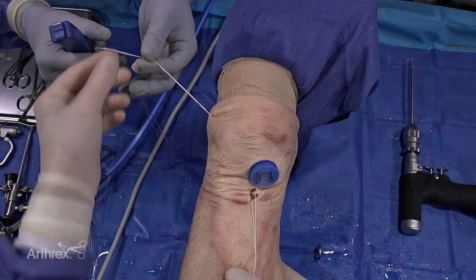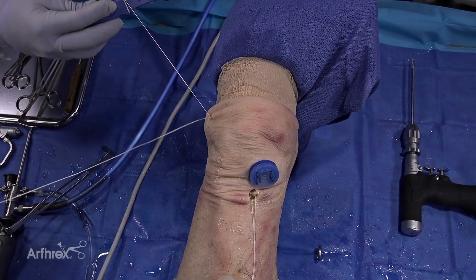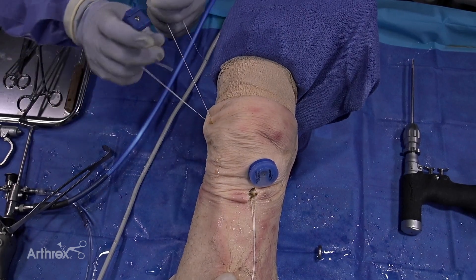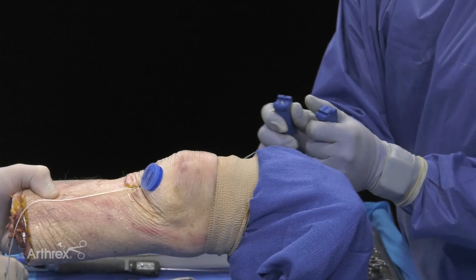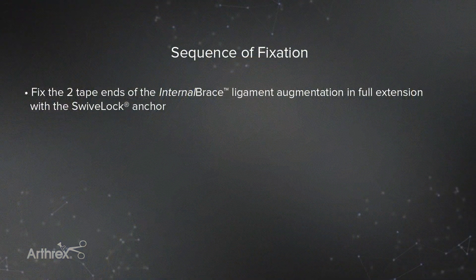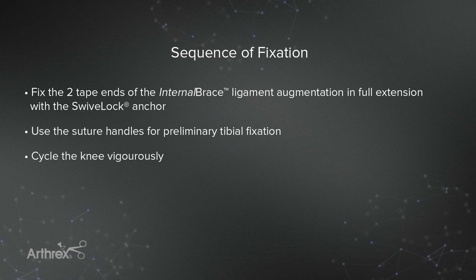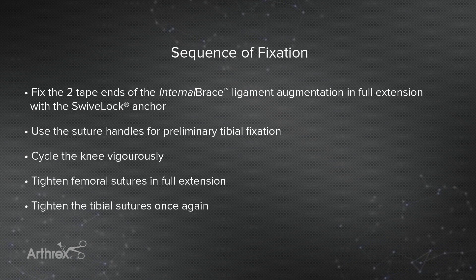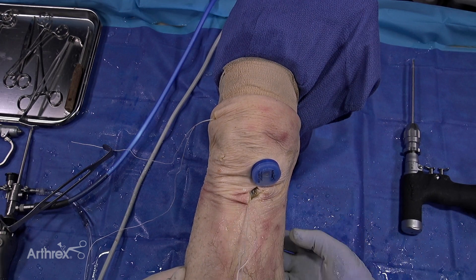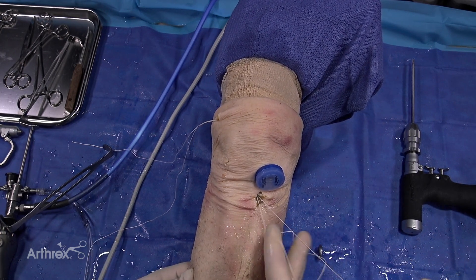Once we've done that, we go back to fully extended position and take out our passing suture for the femoral button, since we know we're in good position on the femur. We apply the tensioning handles to the femur and, keeping the knee fully extended or hyperextended, we re-tension. If there was any creep in the system from that vigorous range of motion, we can take it up. Then I come back to the tibia one last time. The sequence is: first fix the two tape ends for the internal brace at full extension with the swivel lock; preliminary tibial fixation with the handles; cycle the knee vigorously; femur again in full extension; then tibia one more time. Since the sutures are right here, I tie them to the button for backup fixation — the button is right on the bone. I've never had to take a button out; these are low profile.